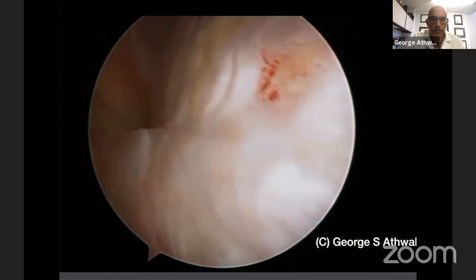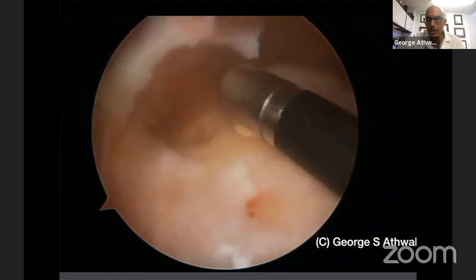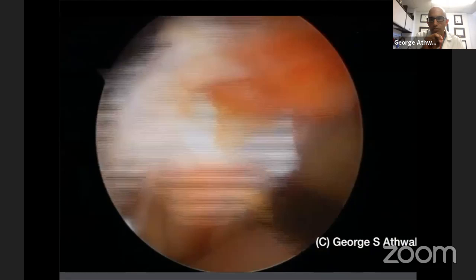So I'm going to make a transosseous tunnel, just like an ACL reconstruction in the knee. We're going to do a transosseous tunnel from the back of the humerus through the humeral head to the front of the humerus.